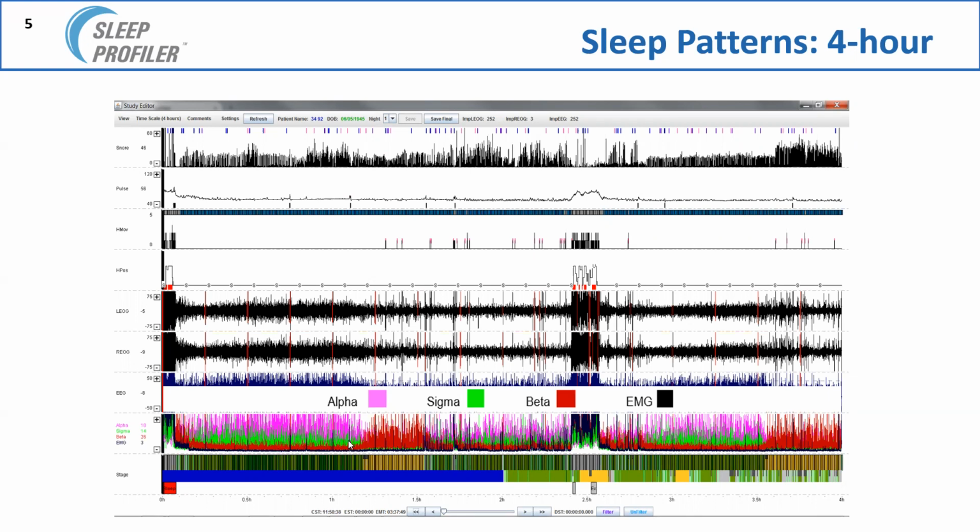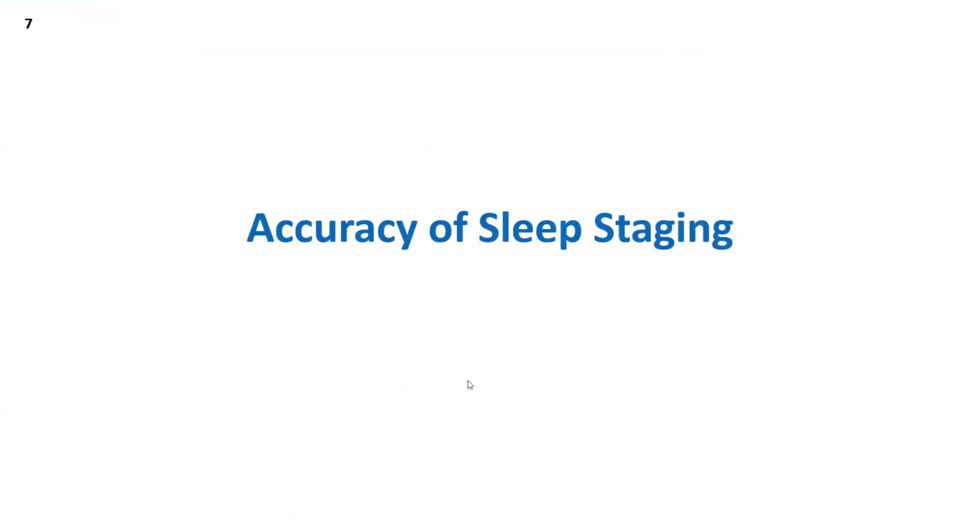And then you can see the transitions from non-REM to REM sleep where the beta power gets much, much greater and the sigma power is very, very low. So here you can see, again, the patterns going from non-REM to REM. There's a little bit of a longer transition to get into deep non-REM, an awakening, again deep non-REM sleep, and REM again.